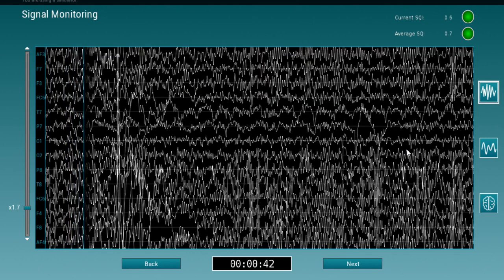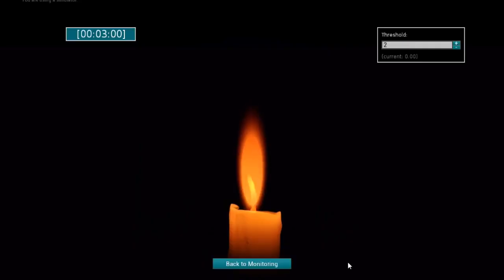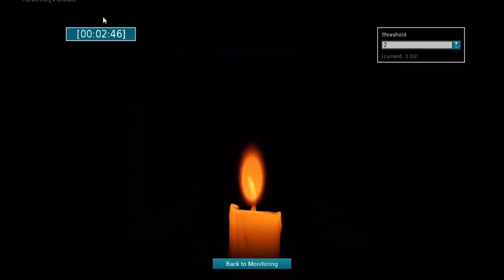Once you're happy with the quality of the data you're recording, just press Next — you can now start the neurofeedback session. The amplitude of the candle is directly modulated by the activity in the Brodmann area you previously selected. On the top left-hand corner, you will see a countdown indicating how much time is left for the session. Further information is also displayed — for instance, bad signal quality is indicated in yellow.